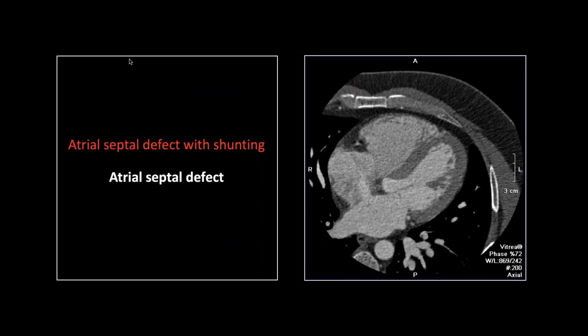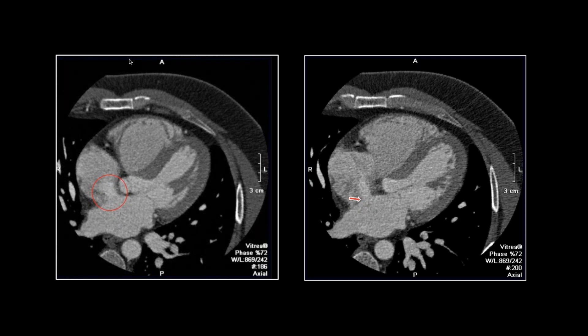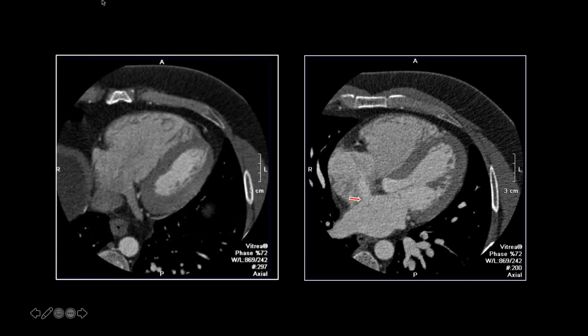Our next septal case is a great case of an ASD. You can see left-to-right shunting, the exact type you would expect in an uncomplicated ASD. The thing I always remember about this case is I did not spot the ASD right off, and the reason is I have a search pattern. It was taught to me by my old cardiologist partner, who said the best search pattern for coronary CTA is to follow the flow of blood — and he's absolutely right. So I was doing that; I followed the SVC down into the right atrium.